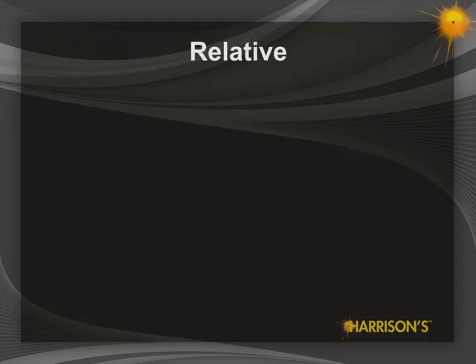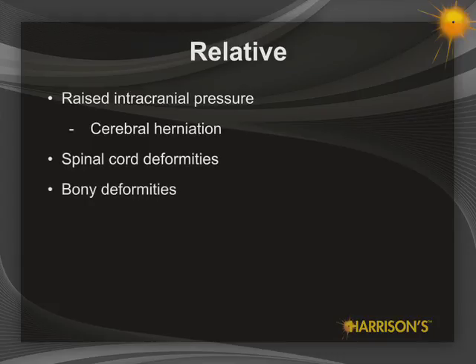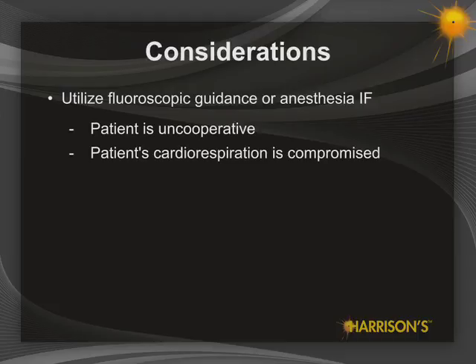Relative contraindications include raised intracranial pressure with signs of cerebral herniation, spinal cord deformities, bony deformities at intended puncture site, or suspected lumbar epidural abscess. Finally, poor patient cooperation or cardiorespiratory compromise may require lumbar puncture under fluoroscopic guidance or anesthesia.